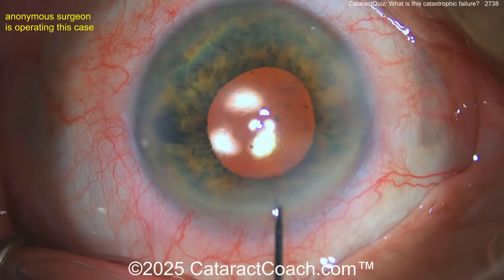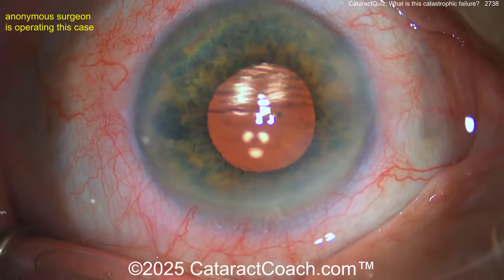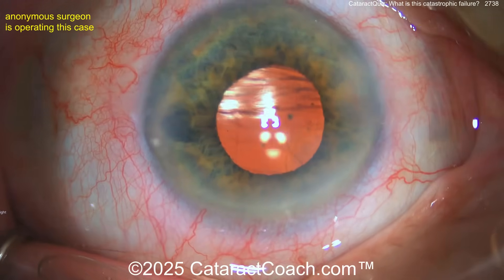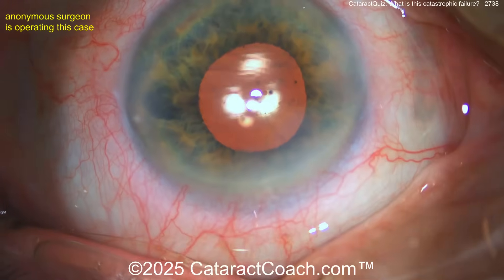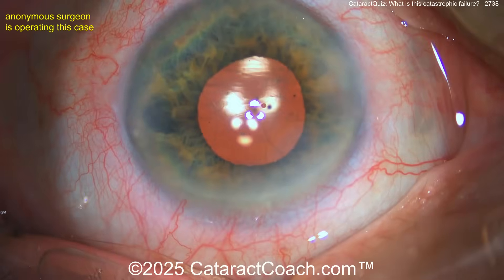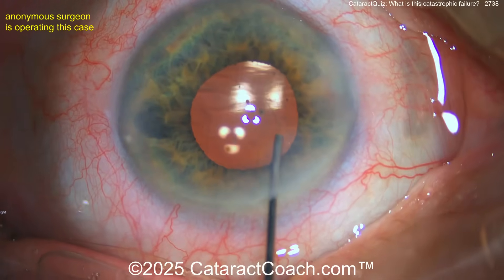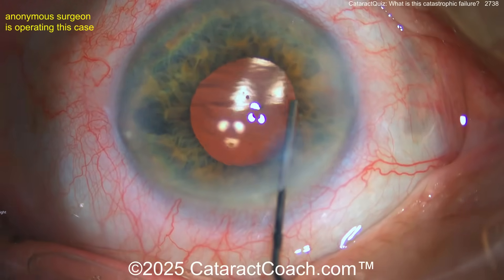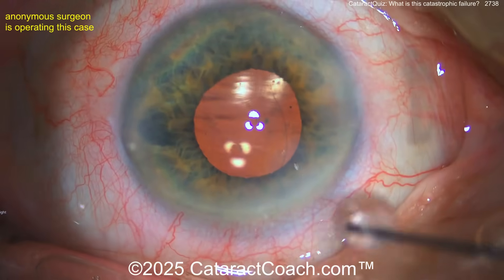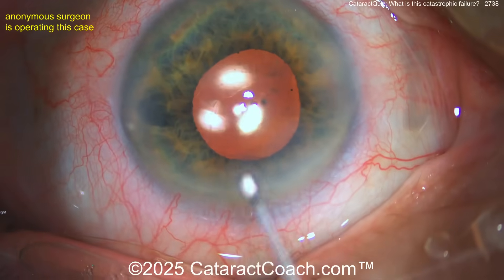You see that line — an OCT would be really helpful here, but we don't routinely use that. The more you manipulate this the worse it's going to be. Go through the left-side paracentesis with a big air bubble. There's a big detachment of Descemet's — very long. That line there is detached Descemet's, not the capsule; it's anterior, right up against the corneal endothelium.